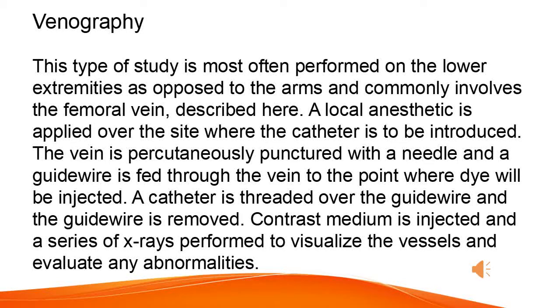A catheter is threaded over the guide wire and the guide wire is removed. Contrast medium is injected and a series of X-rays performed to visualize the vessels and evaluate any abnormalities.